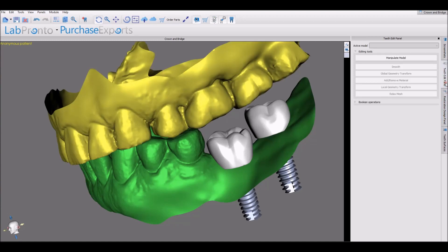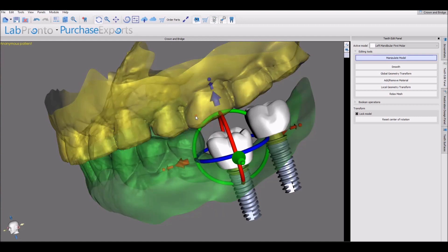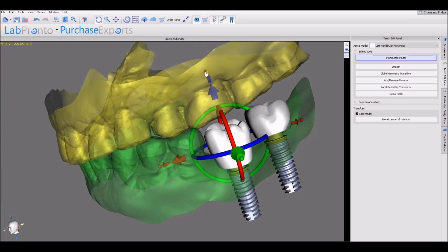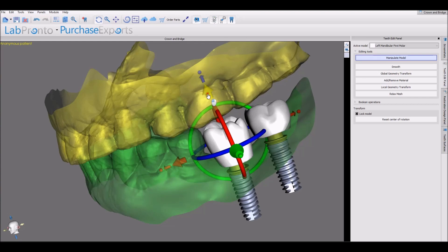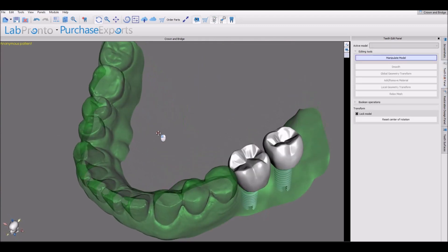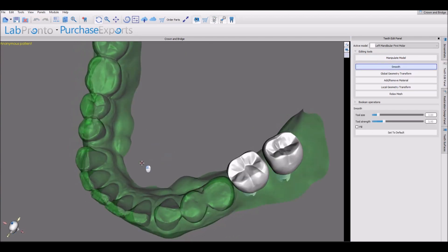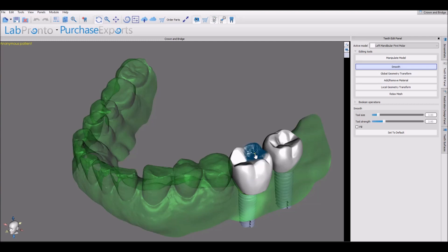At this point we can go to our Teeth Edit panel and we can make any modifications to the teeth. If you right-click on the model and choose Toggle Transparency, we can see through the models and we can now modify the positioning and the size of the teeth. We can also use different editing tools that we have at our disposal. We have a Smooth tool — hold down the Shift key and use your left mouse button to smooth any surface.